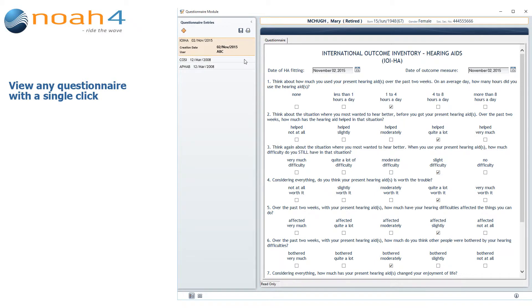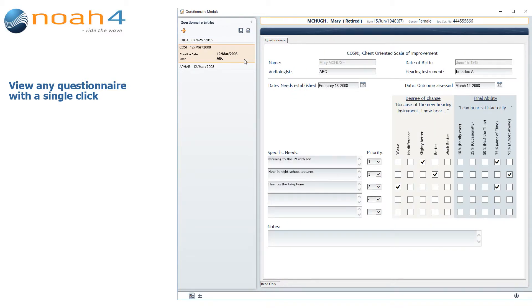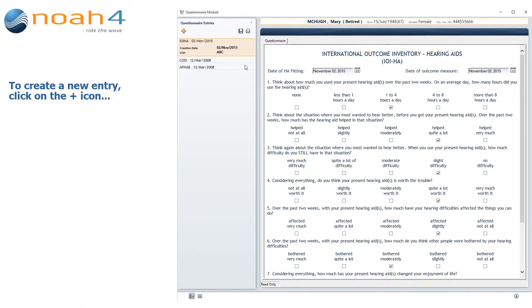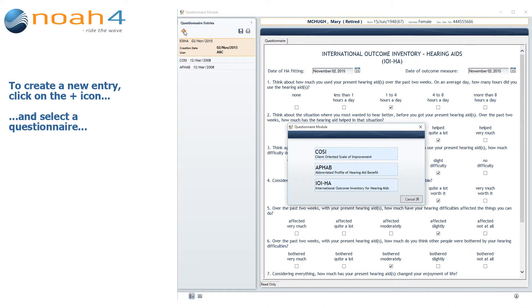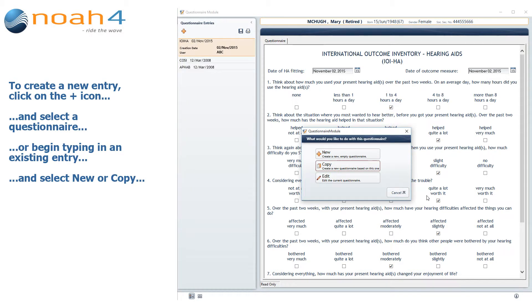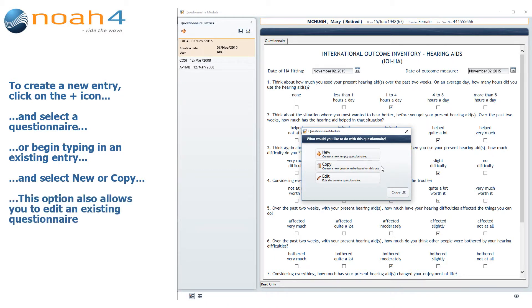You can quickly view any patient questionnaire with a single click. To create a new Questionnaire entry for a patient, simply click on the Plus icon and select either COSI, APHAB, or IOI-HA. Alternatively, you can click on a Saved Questionnaire, where you will receive additional options for creating a new empty Questionnaire, or for creating a new Questionnaire based on the current one. Clicking on a Saved Questionnaire also gives you the option of editing that entry.